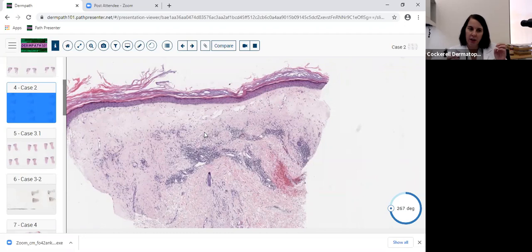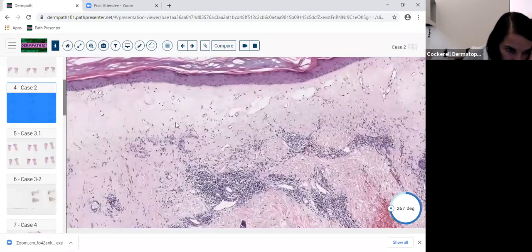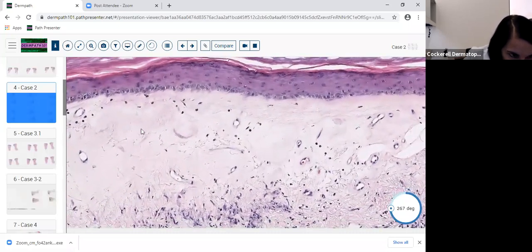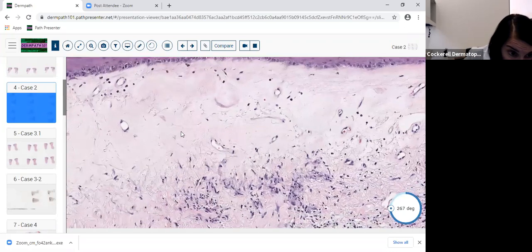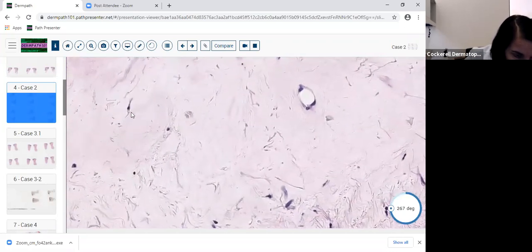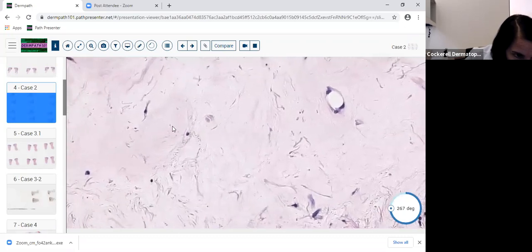And how to differentiate it from radiation. Radiation, you're going to see bizarre fibroblasts. So take a second to look in here and see these fibroblasts. There's not many fibroblasts. The fibroblasts are very much decreased. I'm having trouble finding one. I think here, we have one here, and that one does not look bizarre.